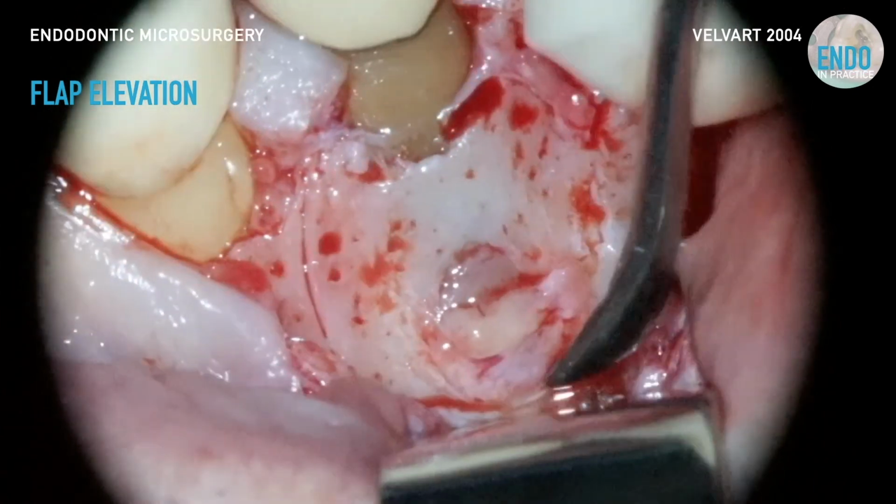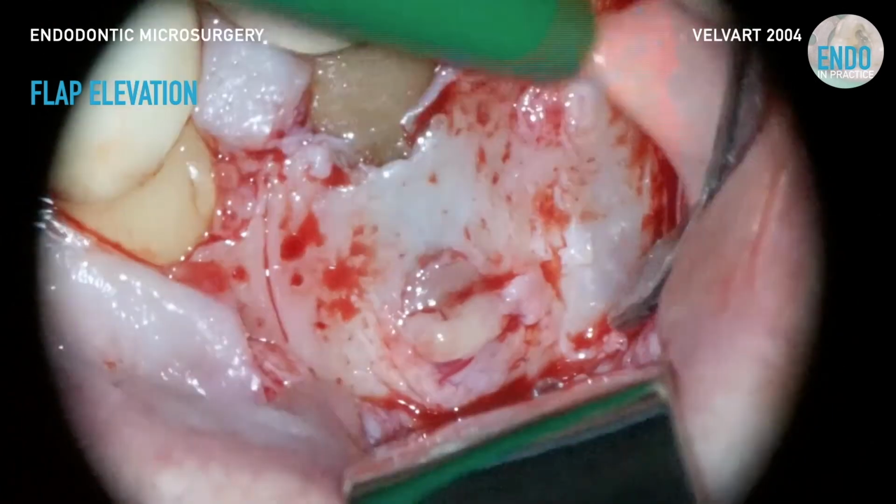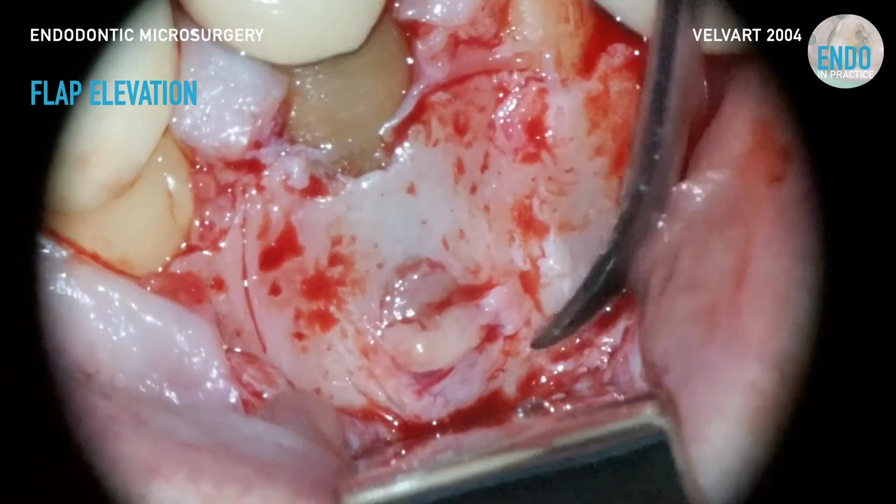Sometimes you'll have to dissect the lesion from the flap because it's perforated the labial plate, and that's quite common. But you just want to get a sound tissue margin for your retractor to rest on rather than resting it on soft tissue. And as you saw earlier, then start to remove that little soft tissue lesion from its crypt.